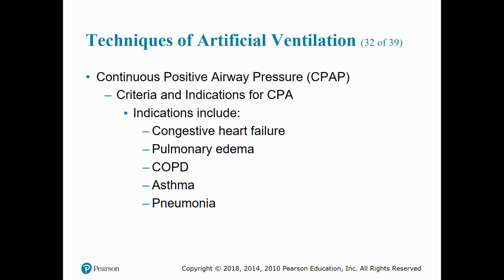The indications for CPAP are a patient in moderate to severe respiratory distress or early respiratory failure, but who is alert and awake enough to obey commands, maintain his own airway and continue to breathe on his own. They may have conditions such as congestive heart failure, COPD, pneumonia, asthma, or pulmonary edema.